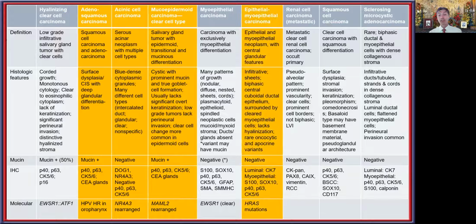And then, of course, when you think about the stroma being either myxoid or mucoid or even hyalinized in some cases, you can tell how it will immediately overlap with some of the other categories that we're discussing. So again, this is a single cell population, right? Because it is all being derived from myoepithelial cells. So even though they may have a multitude of architectures and diverse morphologies, they still are all going to be a single cell population.